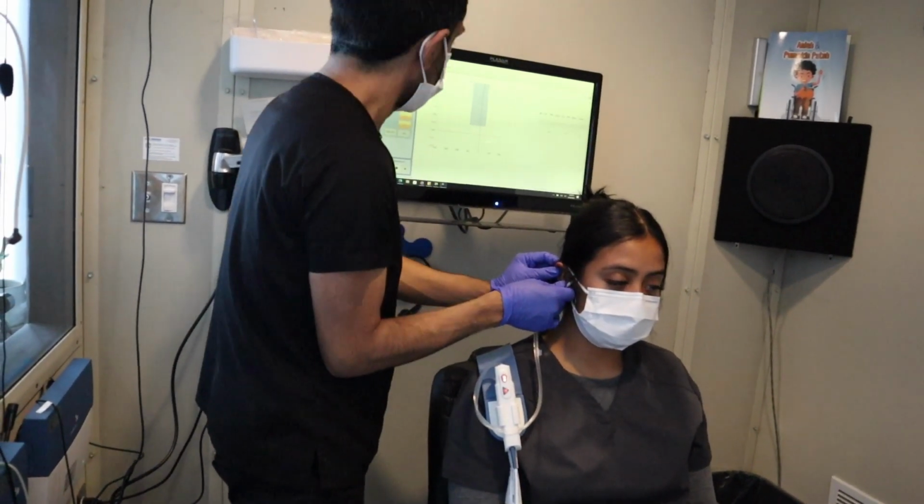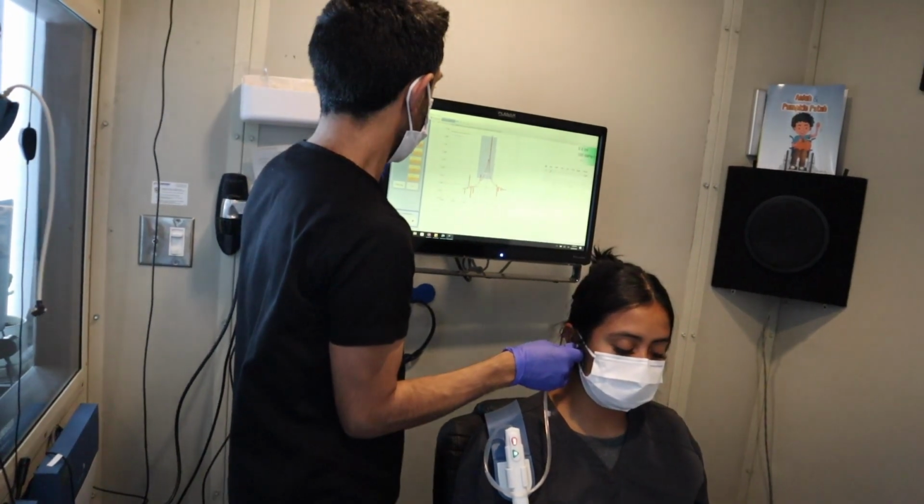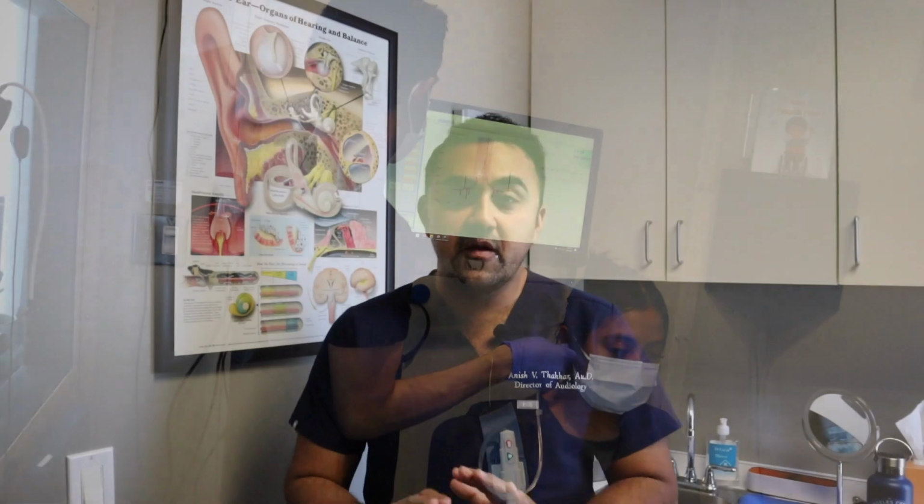During this time, as the patient, you might be just sitting there quietly hearing some loud tones, but it's only for a short amount of time, and there's nothing you need to do because, again, we're testing this involuntary, naturally occurring reflex.